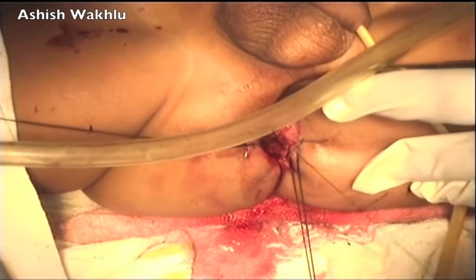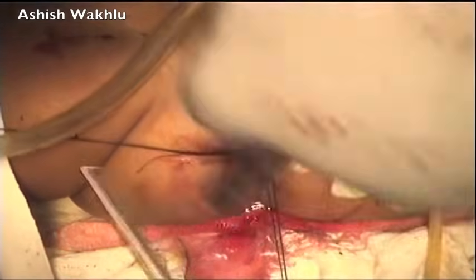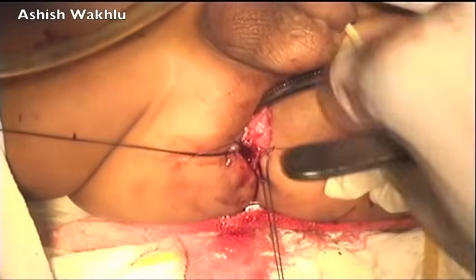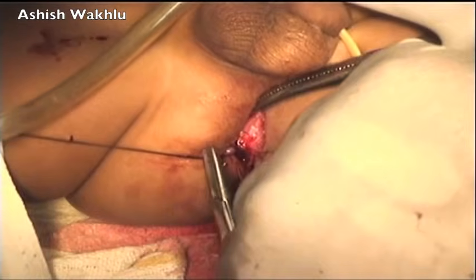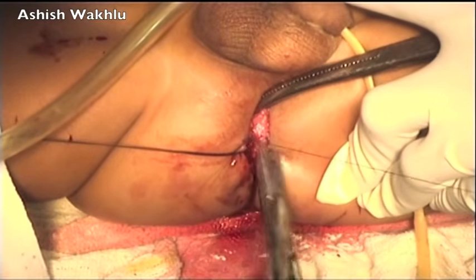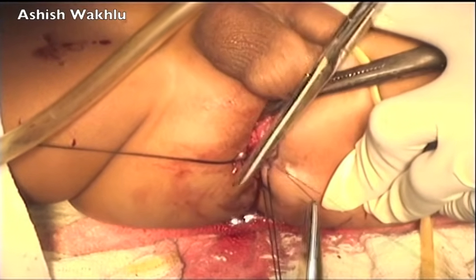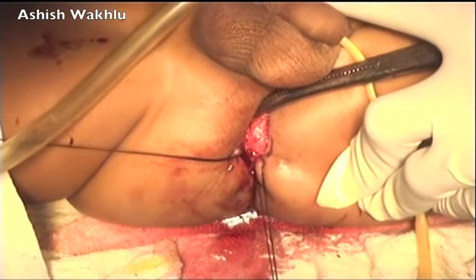It's a time-honored principle of doing an anoplasty that accurate mucocutaneous apposition has to be achieved all around. Some degree of anal stenosis is bound to occur because every anastomosis will shorten by a third, but this can easily be taken care of by a period of postoperative dilatation.